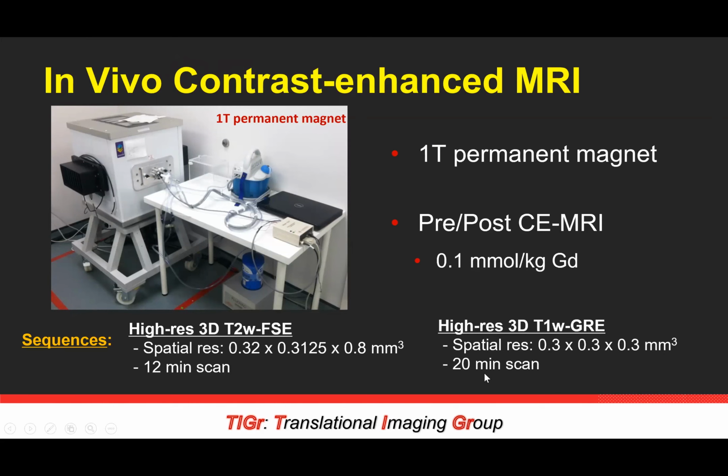Now, I'd like to talk really quickly about the acquisition time for this study and motion gating. A big problem with fetal imaging is we can't just gate for respiratory and cardiac motion for the mother. We also have to be concerned about fetal motion as well, which can't really be gated for externally. Our only real recourse is to acquire multiple acquisitions and throw out averages that have a lot of motion artifact that is a result from fetal motion. So our scan time here encompasses 5 external averages that we have for this gradient recalled echo protocol.